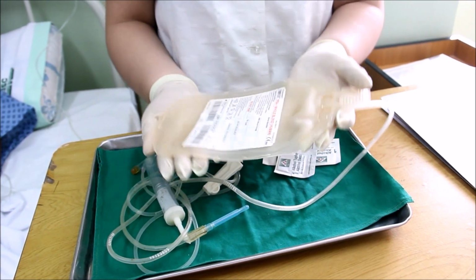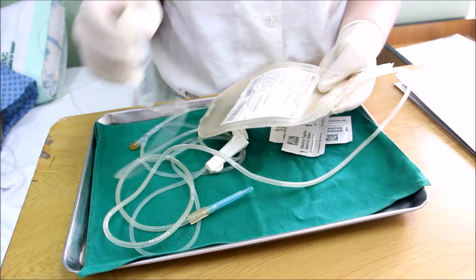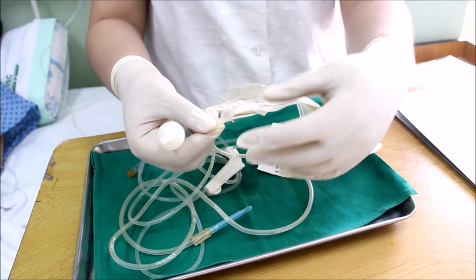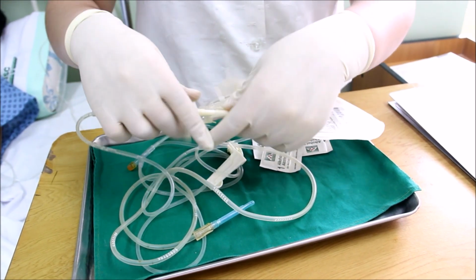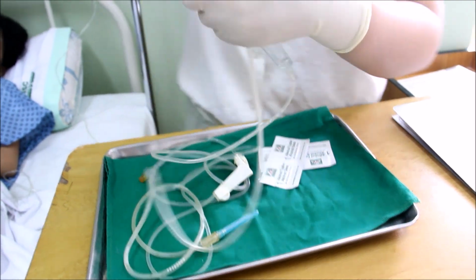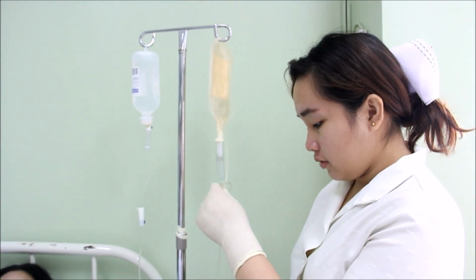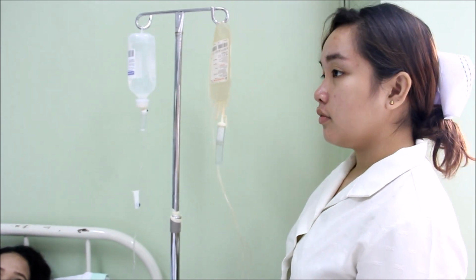Invert the blood bag gently several times to mix the cells with the plasma. Expose the port on the blood bag by pulling back the tabs. Insert the remaining Y-set spike into the blood bag. Suspend the blood bag. Close the upper clamp below the IV saline solution in the Y-set. Open the clamp on the blood arm of the Y-set and prime the tubing.